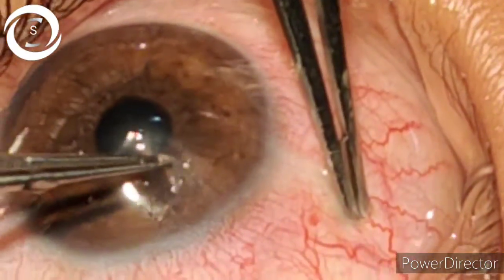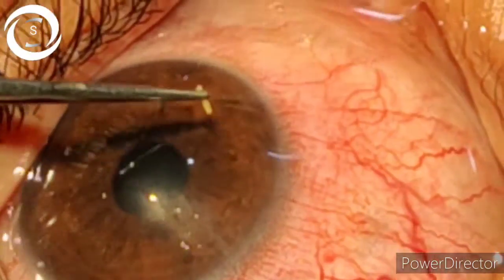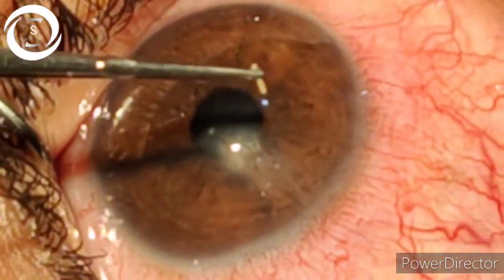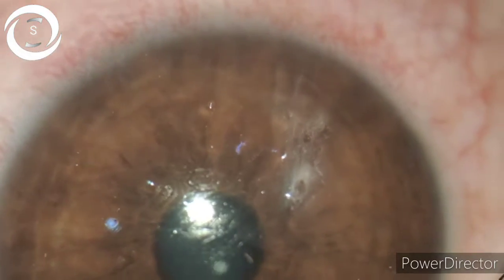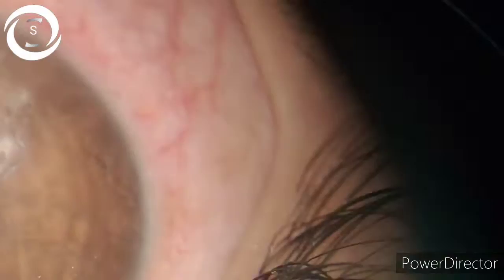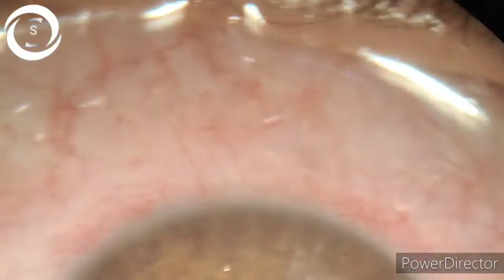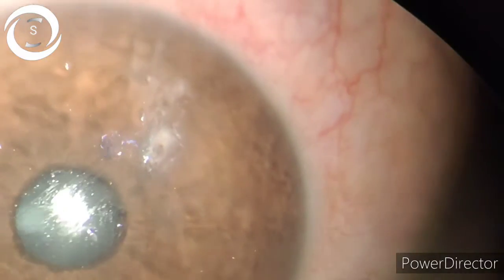So vegetative trauma — you can clearly see now that we have removed both vegetative foreign bodies successfully. We have also avoided anterior chamber collapse, so the anterior chamber is maintained. You can see on the slit lamp the tracks of the two foreign bodies that I have removed. Now we will bandage the eye and give him topical antifungal and antibiotic.